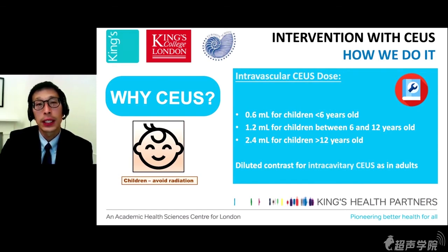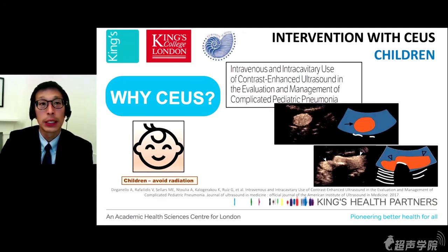And all the things that we talked about in terms of application and intervention, such as biopsies and drainages, can apply in the pediatric population as well. One of my colleagues has looked at chest drainage of empyema, and this is an example she has demonstrated. Using intracavitary contrast enhanced ultrasound, she can show the effectiveness of a drain.